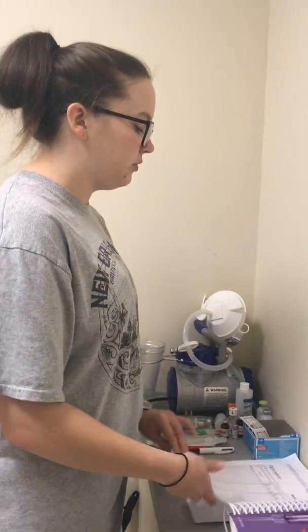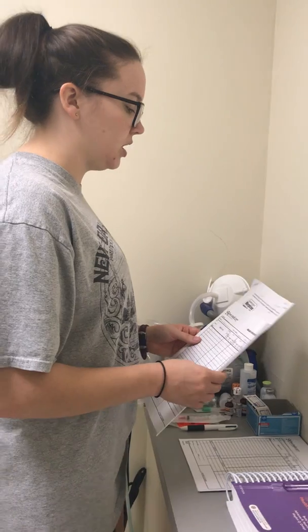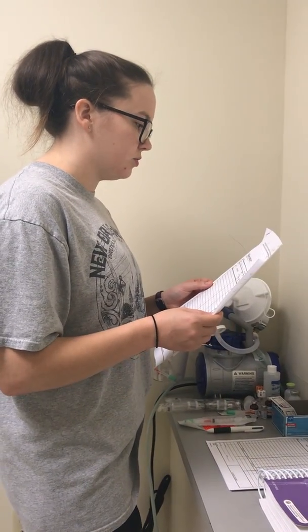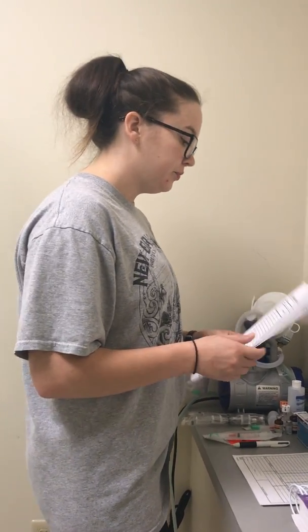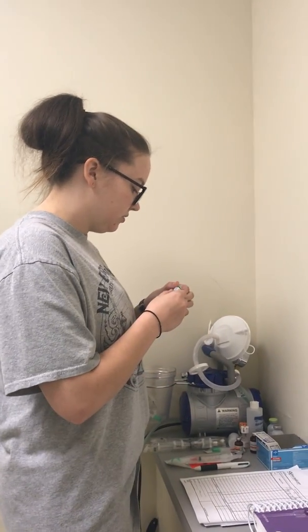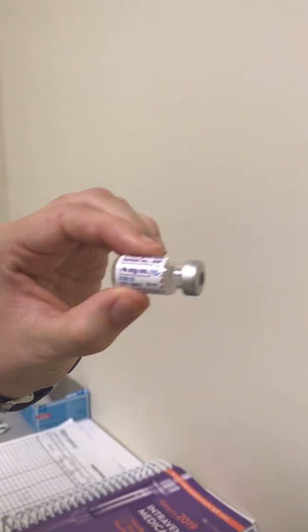Okay, I'm going to start off by looking at my MAR, making sure I have my 5 rights of medication. So the right medication would be the doctor's ordered morphine, 2.5 milligrams IV push every 4 hours as needed for pain. So I'm going to make sure that I get my morphine.